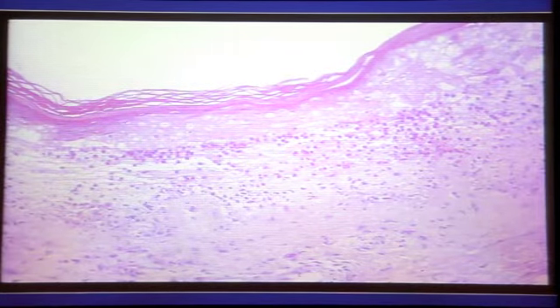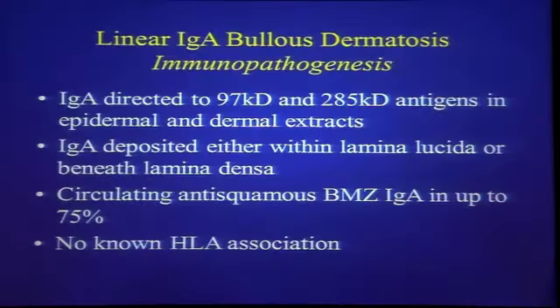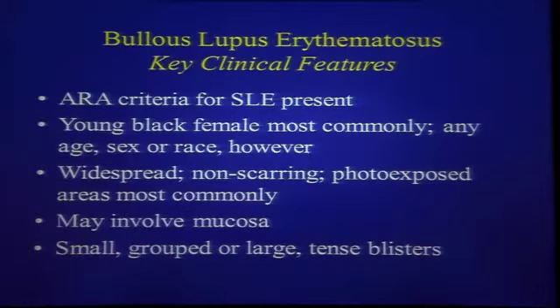This was an adult. She had taken vancomycin for an infection and got this reaction that had abundant neutrophils here beneath the epidermis. And then the immunofluorescence finding with this nice linear band of IgA at the dermal-epidermal junction. So nice example of LIGA.